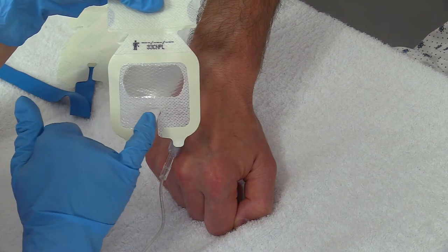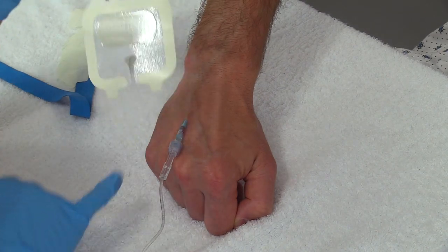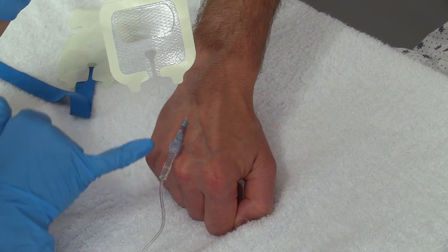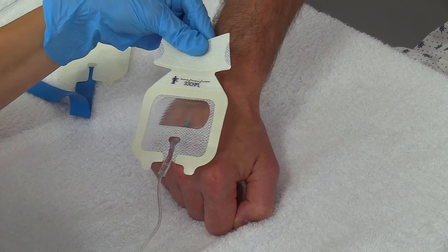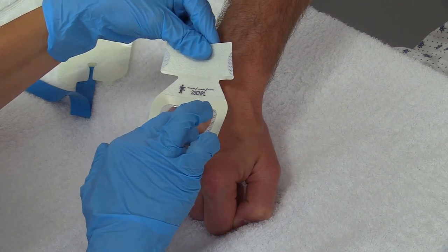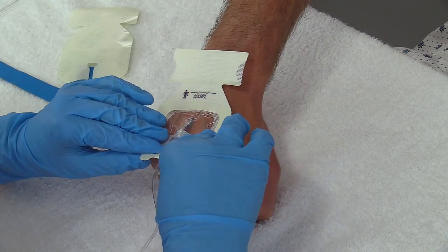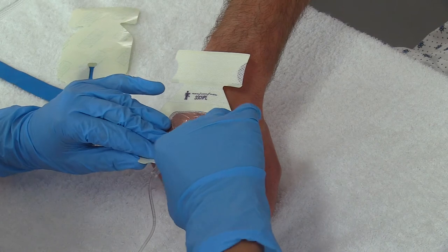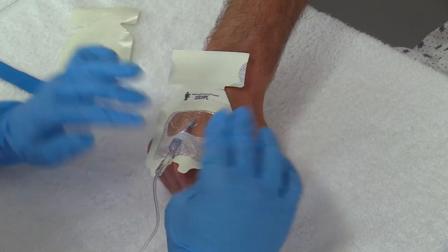It has a notched area, so I want this part to lay on the top of the cap before it goes into the access, the extension set. So I'm just going to lay it there and apply some firm pressure just to get it down on the skin. I'm securing that down.